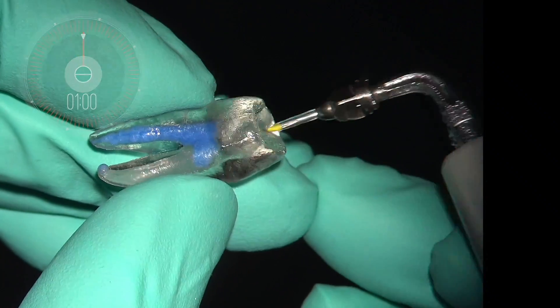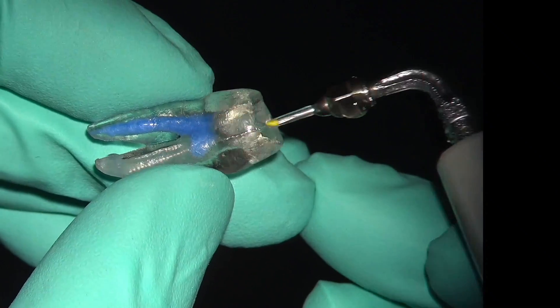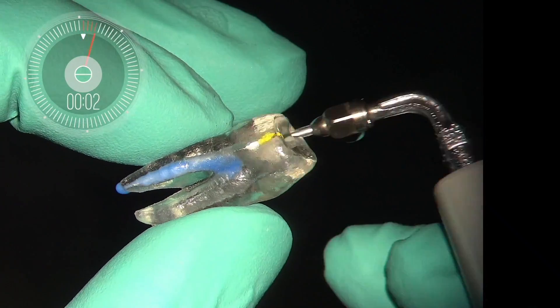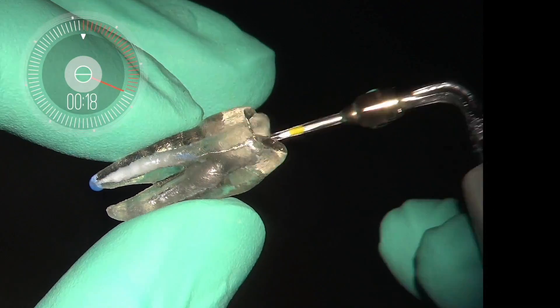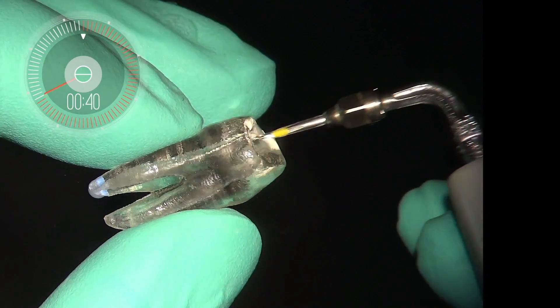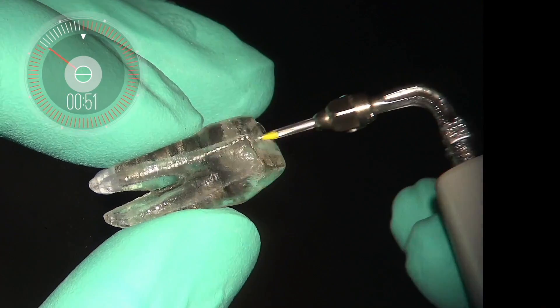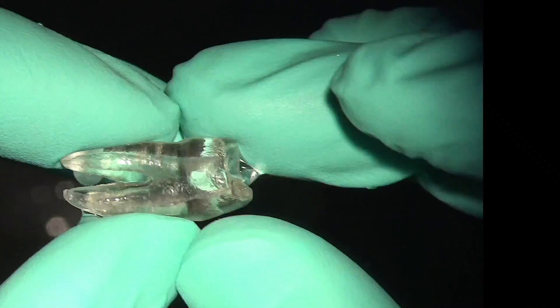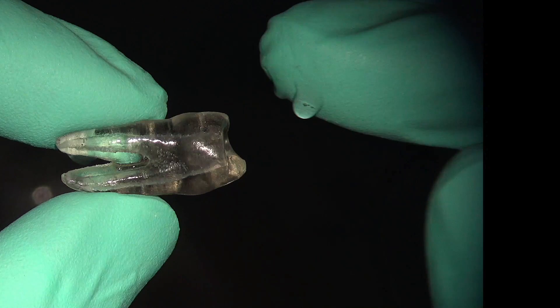During this one minute of activation, the continuous flow of water and its activation with ultrasonic energy removes the viscous gel from each root canal of the tooth. This would be the final irrigation protocol — working about a millimeter from the apex with continuous flow of water, or you could place hypochlorite in the canal at the very end, shut down the water, and then activate the hypochlorite for about 30 seconds to a minute in place to enhance the disinfection aspect of your irrigation. You may need to replenish the hypochlorite a couple of times.